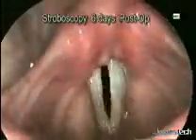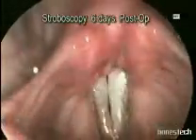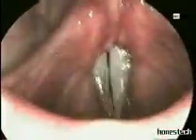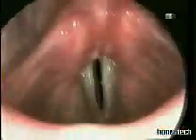The vocal cords are healed. There's chordal vibration. The glottic closure is almost complete. There's still some slight inflammation on the right.